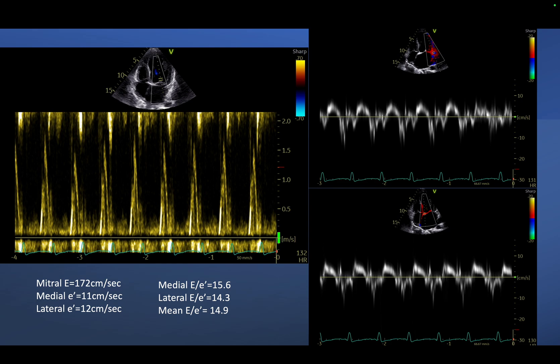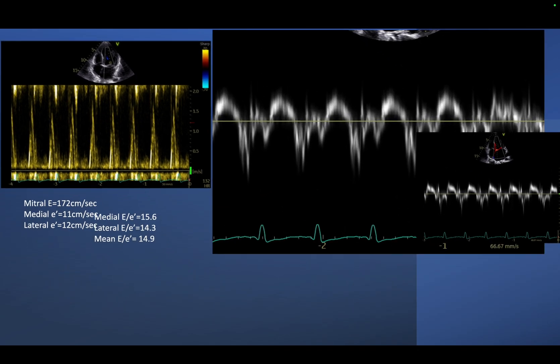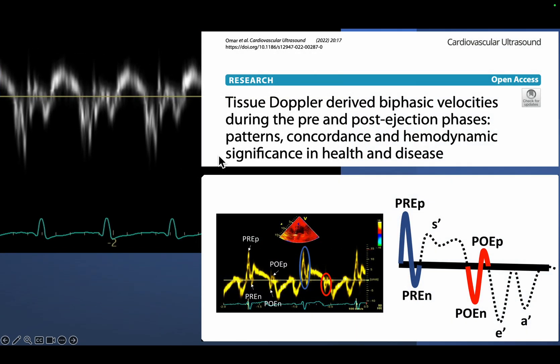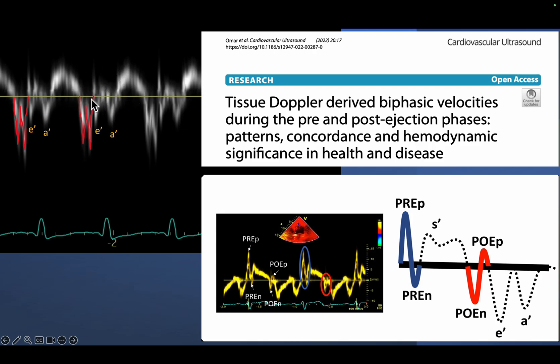We noticed something interesting that I wanted to share. You notice the E wave and E' and A' — but there is also a W-shaped wave occurring in early diastole during the isovolumic relaxation phase of the LV. This wave occurs during isovolumic relaxation and precedes the E' wave, followed by the A' wave.